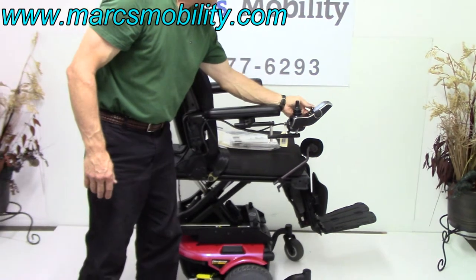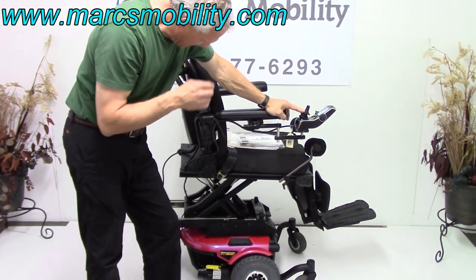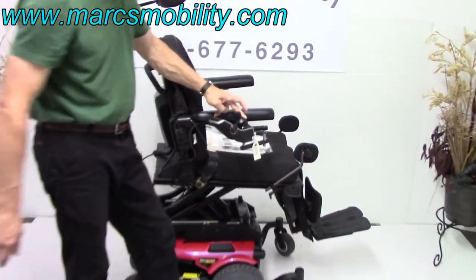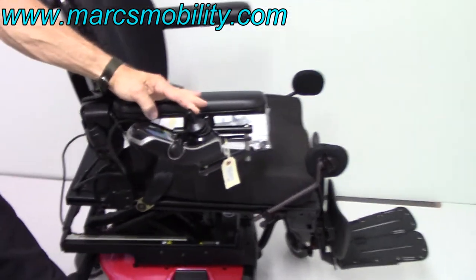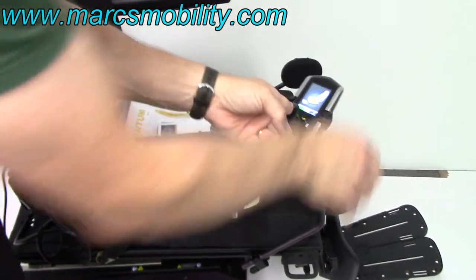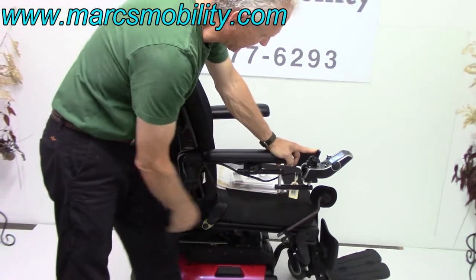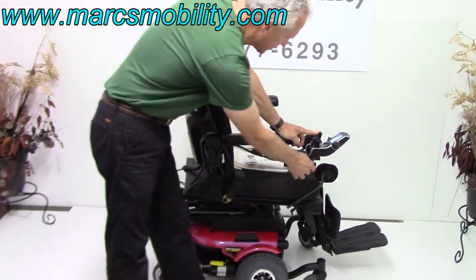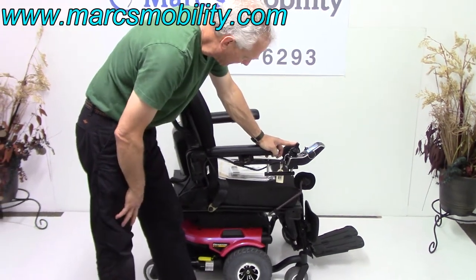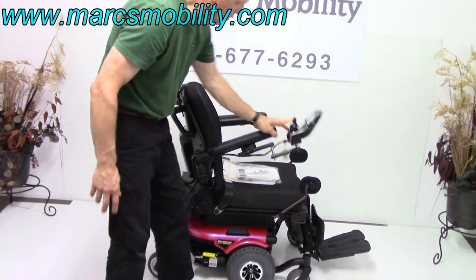We're going to bring the seat back down and talk about the joystick. The joystick is a swing-away joystick — you can swing it away from the front, and you can swing it both ways. We can put this joystick on the left side; this is the newest style joystick, and they're very sharp-looking. The joystick can be on the right, or we can switch it to the left with no problem. The arms go up on both sides, so if you need to transfer, the arms do go up.